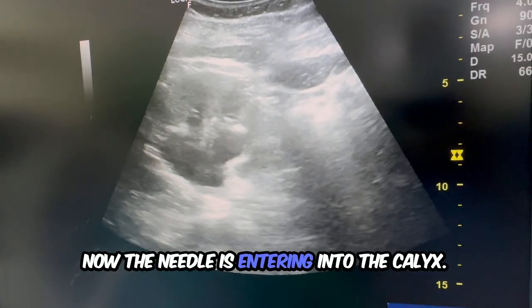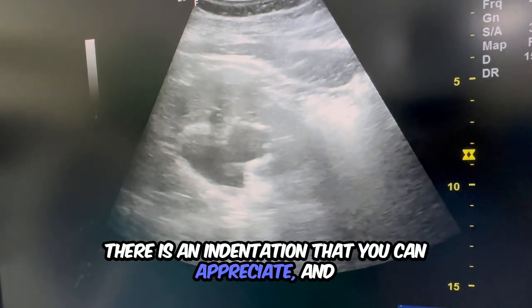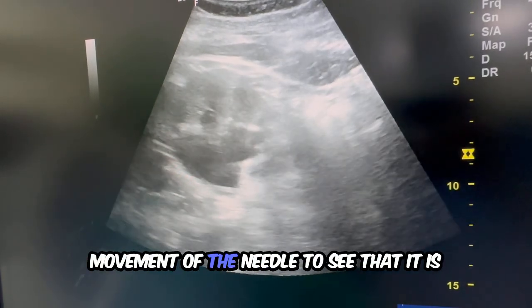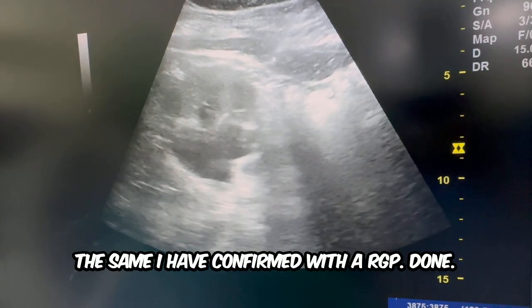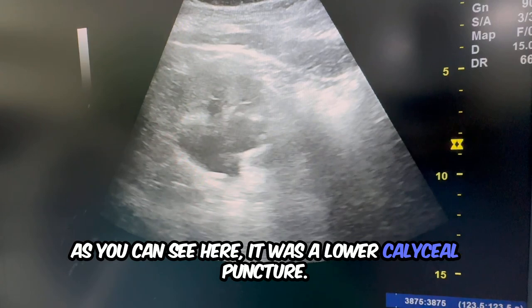Now the needle is entering into the calyx. There is an indentation that you can appreciate, and once I have entered, I made back and forth movement of the needle to see that it is well in place of the desired target. The same I have confirmed with the RGP done. As you can see here, it was a lower calyx puncture.